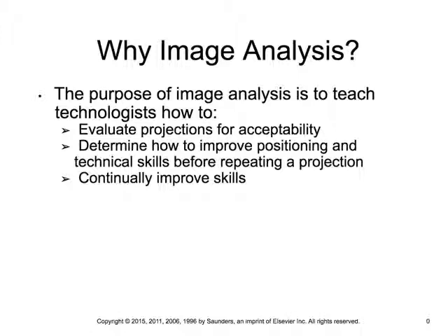It used to be, back in the day, we had positions created just for QC, quality control techs, who just sat and looked at images all day long to determine whether or not they were acceptable or needed to be repeated and what impact that had on the workforce. So it also is going to help us determine how to improve. I think the number one thing that we use this for is, do I need to repeat this picture? We clipped this, the patient's a little bit rotated, is it okay, right? So I'm trying to teach us the criteria to determine whether or not it is okay.